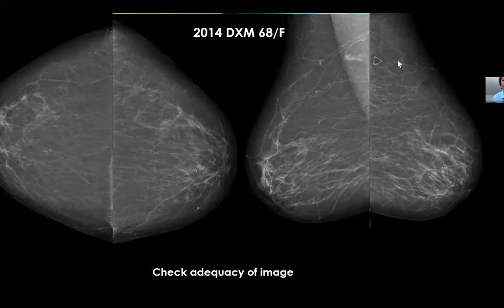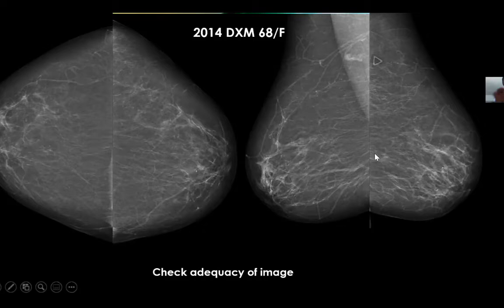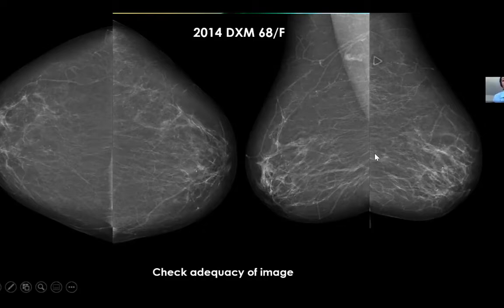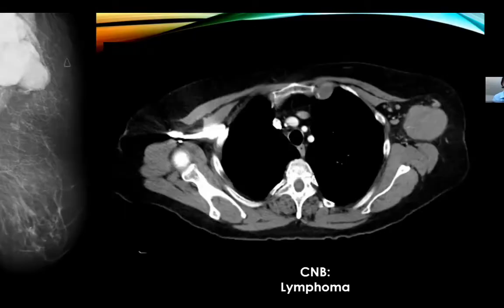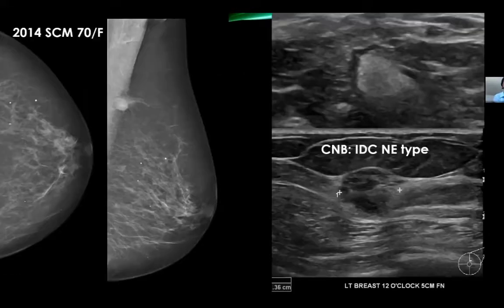If you look at the adequacy of this image, you can clearly see that the left pectoralis major on the MLO view is not seen. Most of the breast tissue should be seen on the MLO view. Don't start with a bad image and miss a cancer as big as a golf ball just because you failed to include the required areas. In this case, it was not a breast cancer — it was a lymphoma and treated as such.